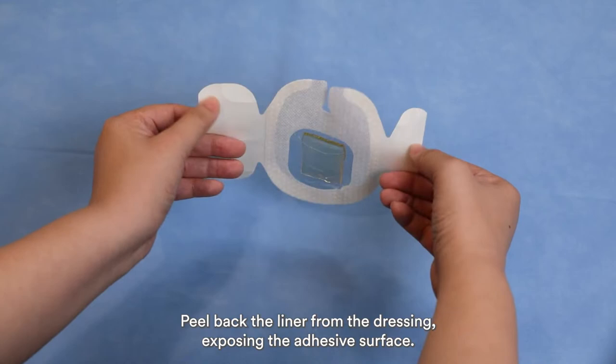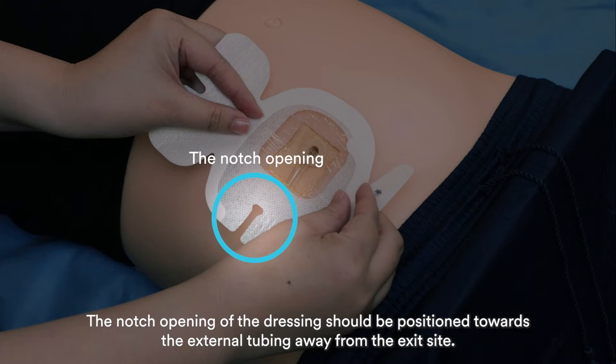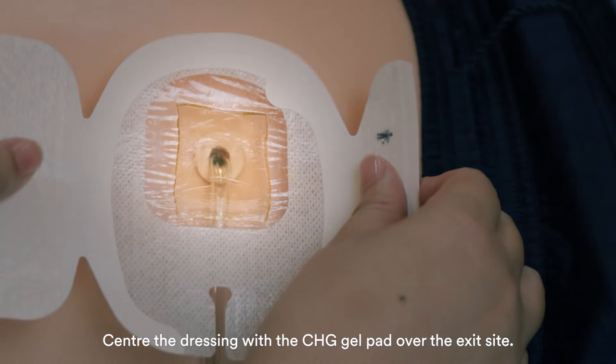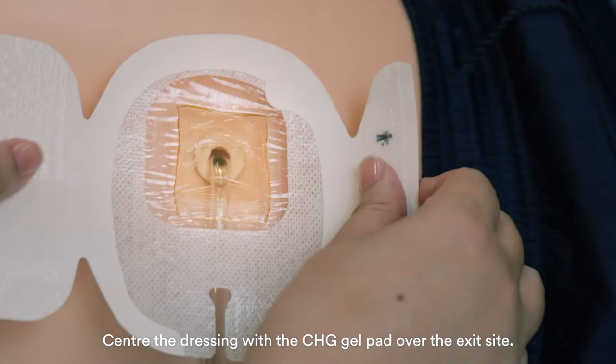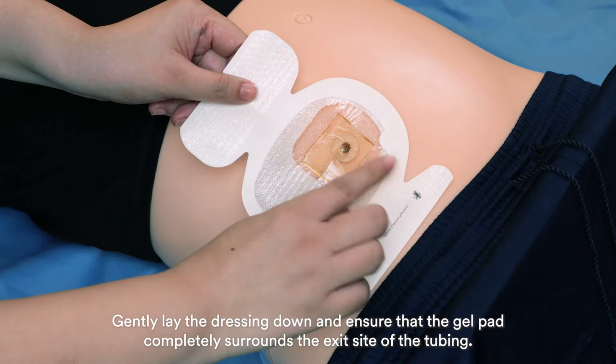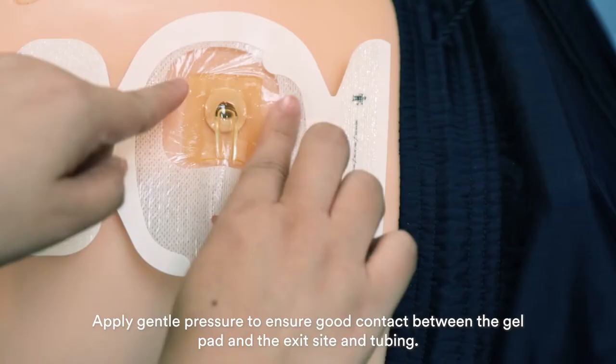The notch opening of the dressing should be positioned towards the external tubing, away from the exit site. Center the dressing with the CHG gel pad over the exit site. Gently lay the dressing down and ensure that the gel pad completely surrounds the exit site of the tubing. Avoid stretching the dressing during application to reduce the risk of skin trauma.